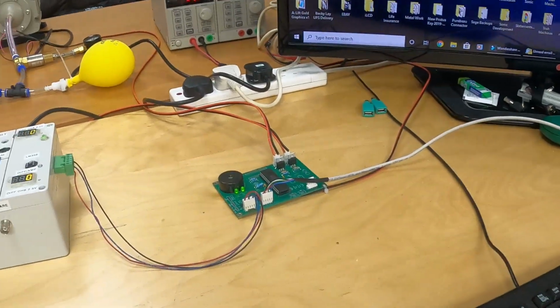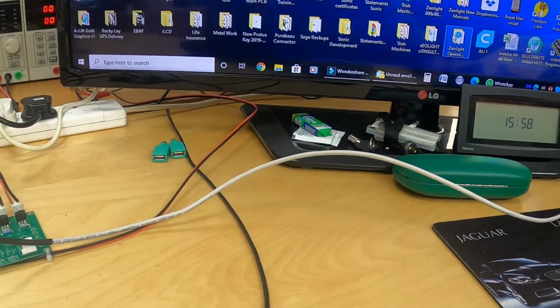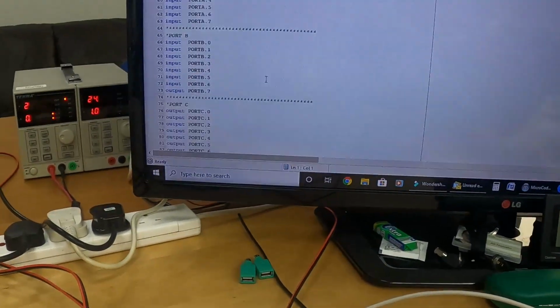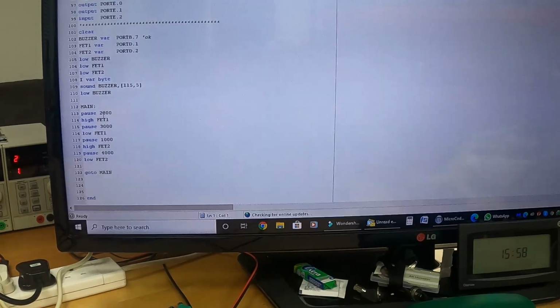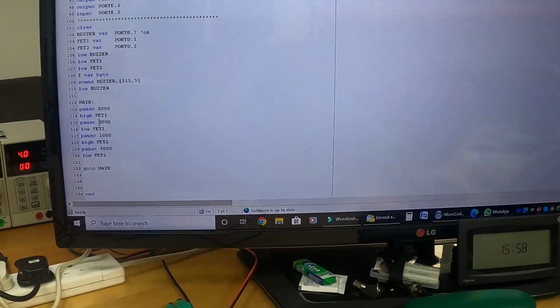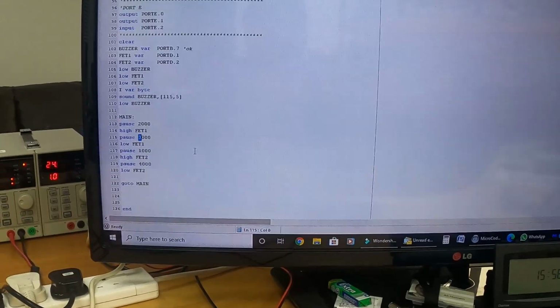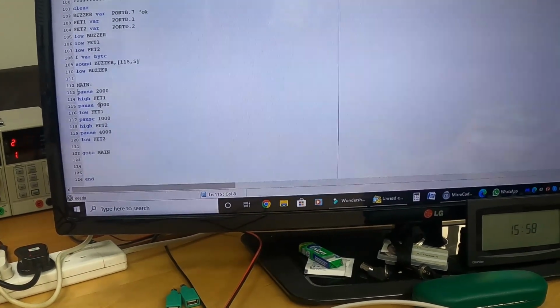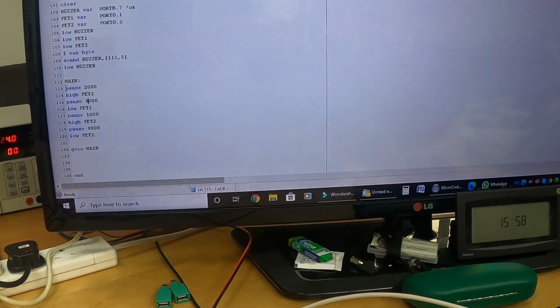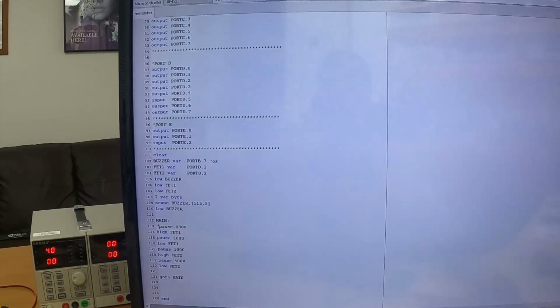Alright, let's change some of the timings here, and I'll show you. Right, sorry about the flickery screen. Okay, so let's say I want here to go for 4 seconds, 4 seconds out, and no pause to begin with, so we just go up here, file, compile and program.